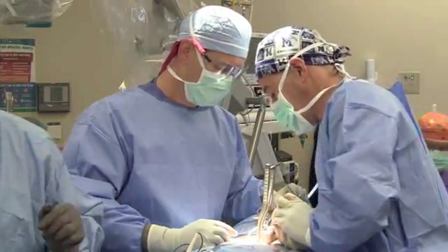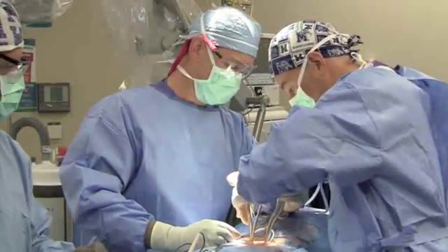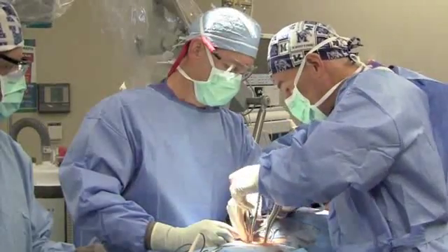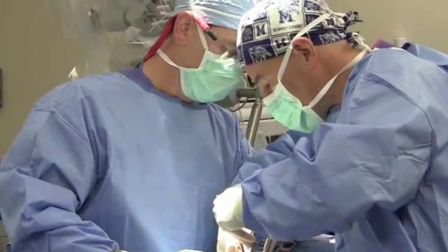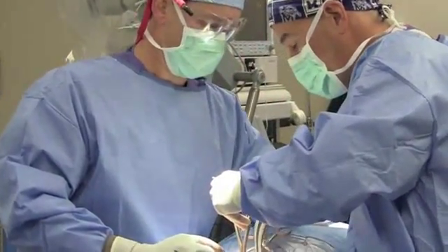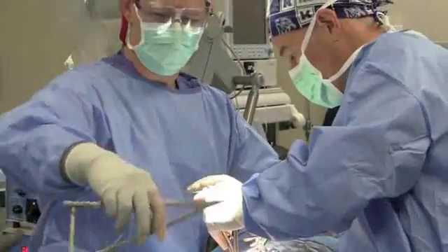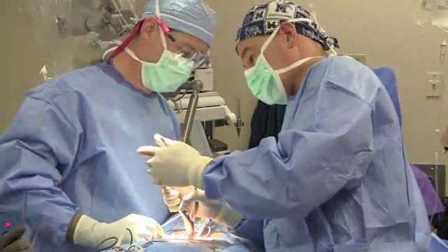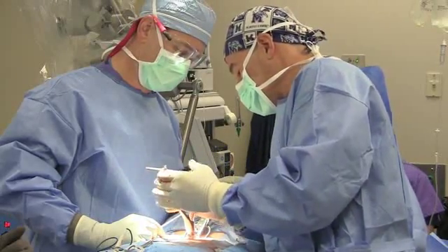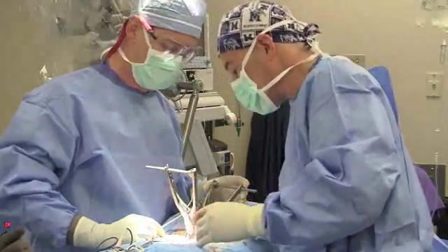Once the device is in place, we have a series of clamps that go on and allow us to clamp down along the spinous processes. This keeps the vertebrae distracted and holds it in place while allowing for the fusion to take place. You can see here the device is in, and now we're clamping that down — squeezing on either side of the spinous process, which gives us our stability.